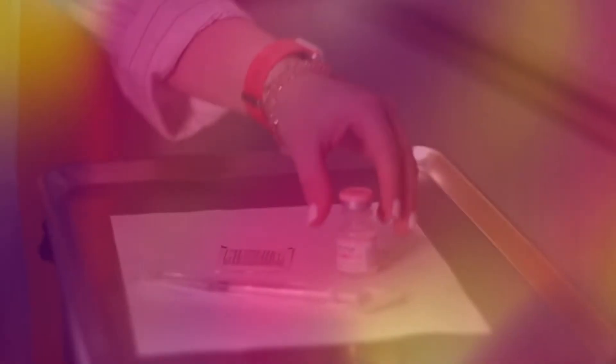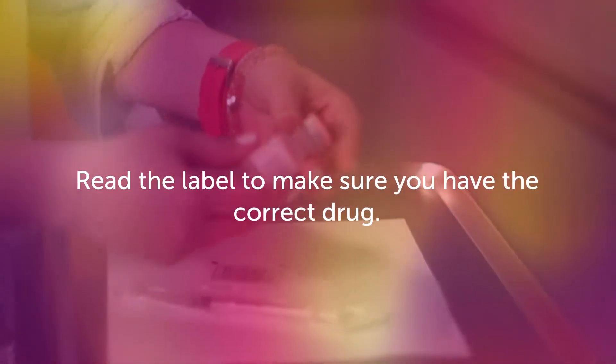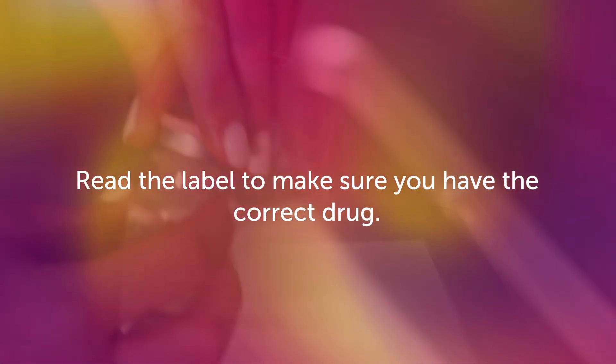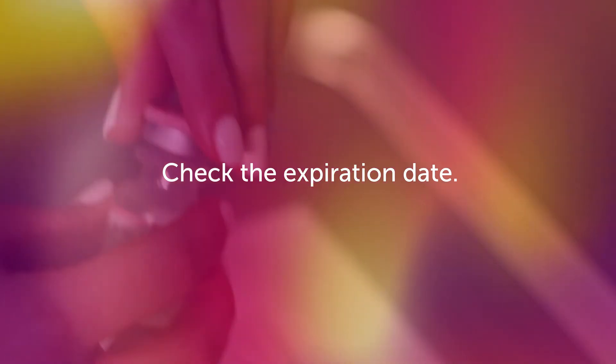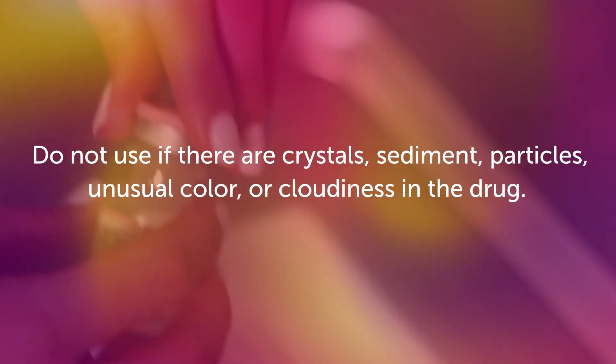Looks like we have all of our supplies. Alright, let's get started. Before giving the medication, read the label to make sure you have the correct drug. Check the expiration date. Do not use if it is expired.